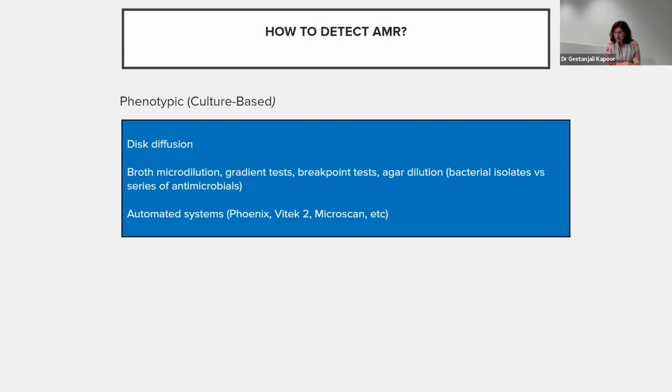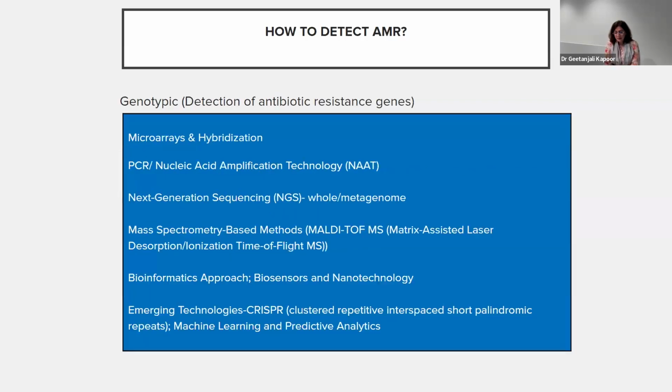Even the microdilutions are not all that simple. They do require resources. It's a little intensive. And it again depends from facility to facility what is ideal for their situation. Still, at least something should be there so that whatever report is there at the end of the diagnosis and diagnostic testing, it is based on some kind of evidence.